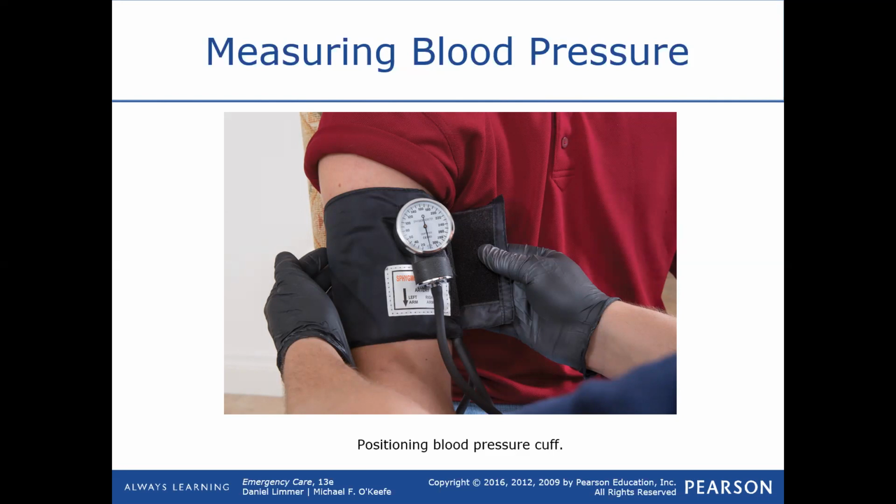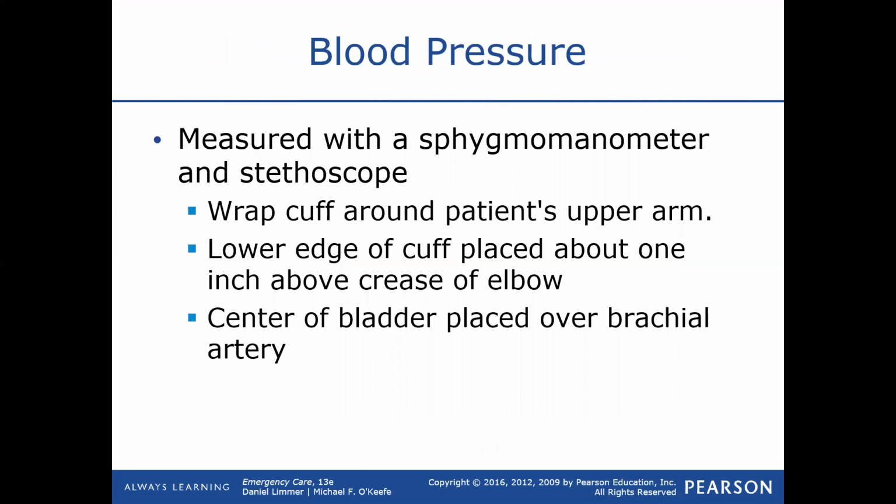So always look at it before you put it on the patient. As long as it's down in that little zero mark, you're great. If not, grab a different cuff and then get this one fixed or replace it. I mean, they're pretty cheap to replace anyways.